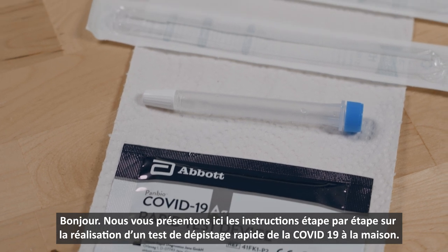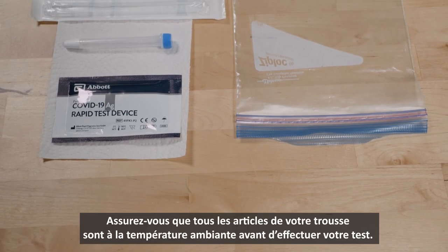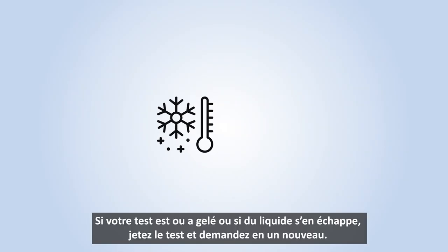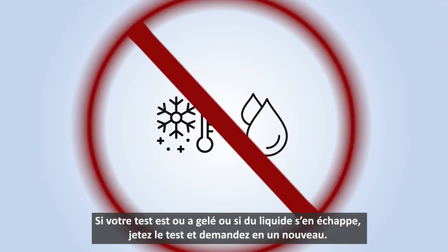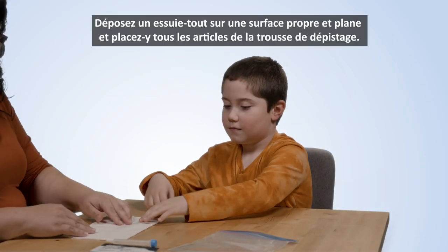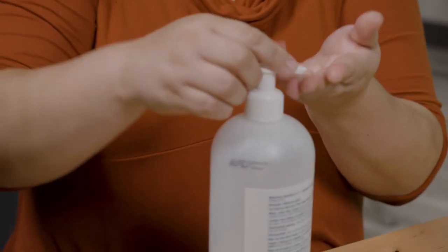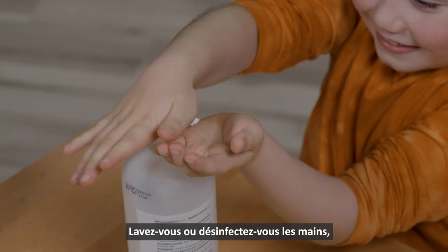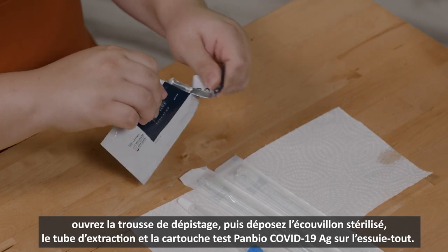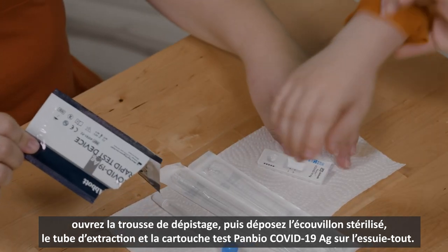Welcome to the step-by-step instructions on performing your at-home rapid test for COVID-19. Make sure all items in your kit are at room temperature before performing your test. If your test was frozen or leaking, throw the test away and request a new one. Have a clean, flat surface with a paper towel positioned to place all the testing components on. Wash or sanitize your hands, then open the testing kit laying the sterile swab, test tube, and at-home pan-bio COVID-19 AG test cartridge on the paper towel.